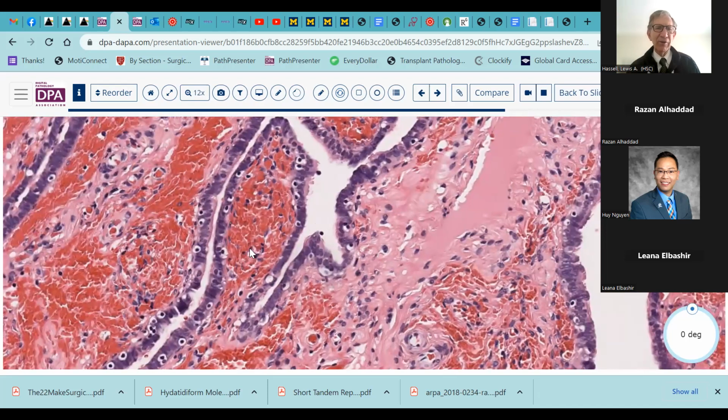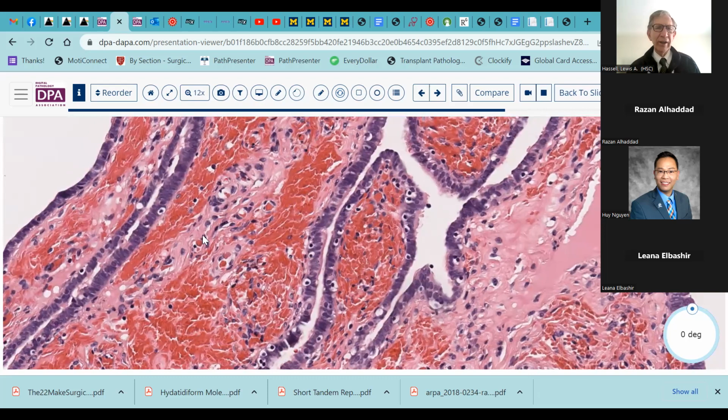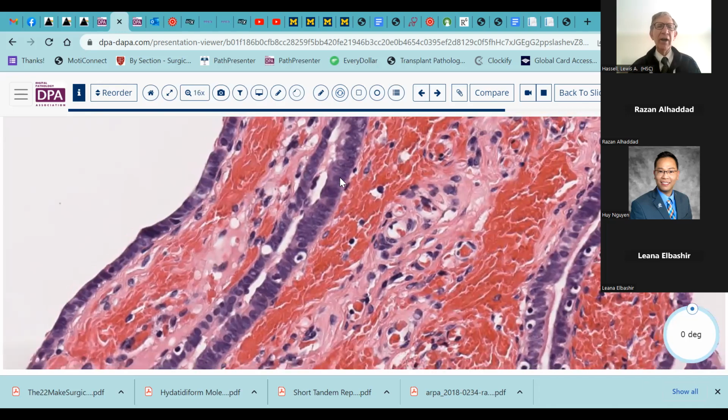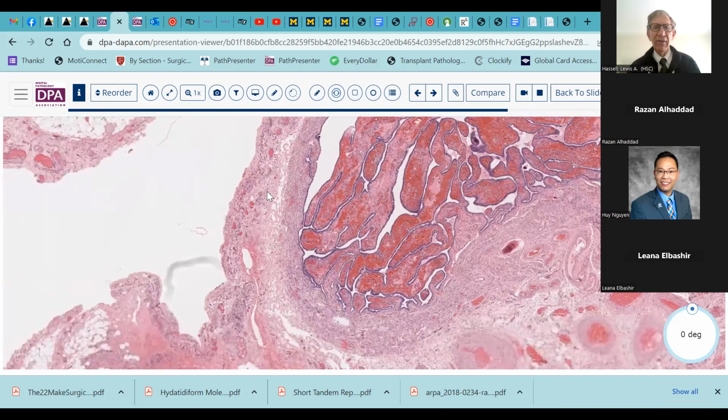But if I'm just seeing stuff like this, I wouldn't do a P53 stain unless I began to see areas that I could truly classify as having some nuclear atypia. And here again, you see nuclear enlargement, filling almost the full size of the cell. It's very, very focal here, but this can be a multifocal disease.